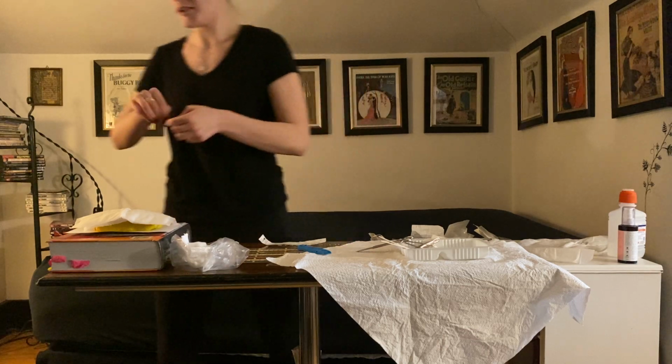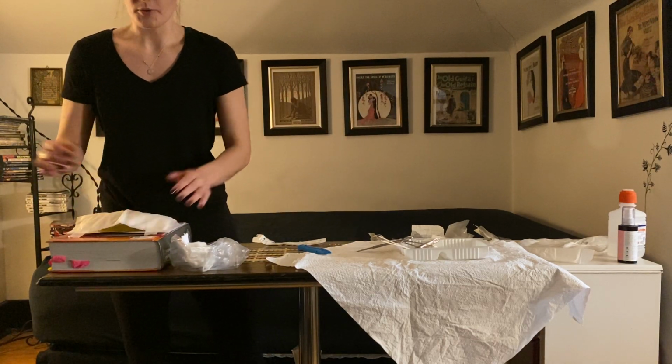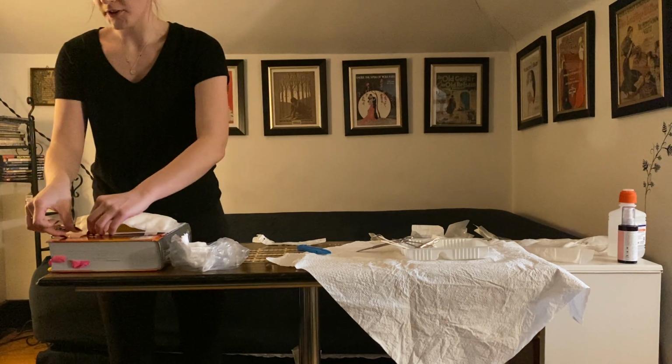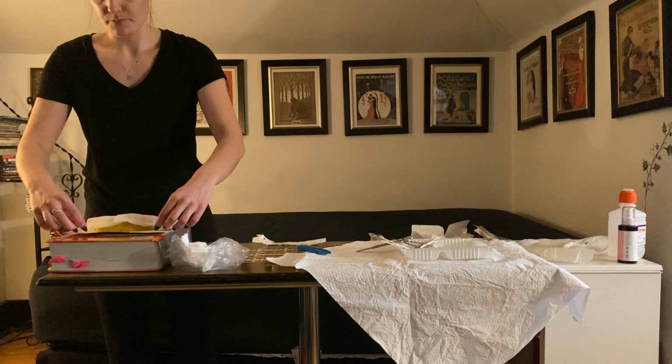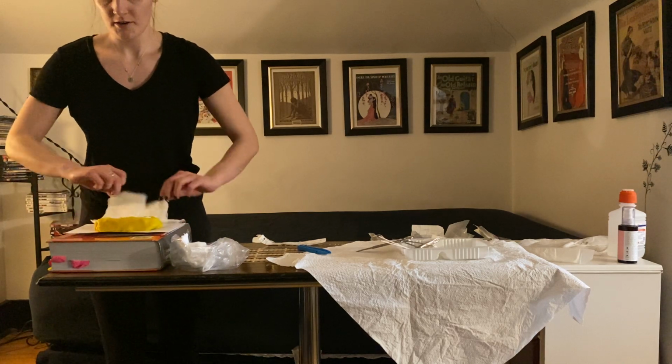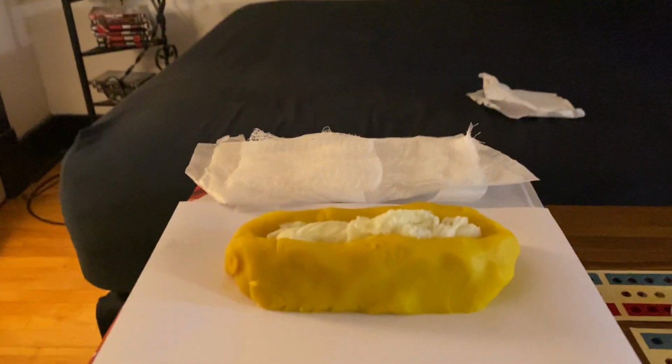Okay, and then that would be my dressing change, and then I would document about it as well. But just for the purpose of this video, I do want to show you what my packing looked like. So I'm going to take that away. I'm just going to show the camera here. So there we go.